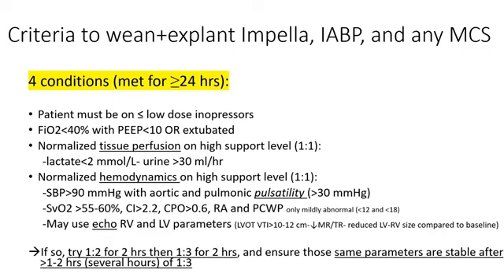So it's nice to have a mechanical circulatory support to support the patient during the stress and loading increase of extubation. The counter argument is that, okay, you tolerate extubation more if you have balloon pump in place, but guess what? You tolerate weaning the balloon pump more if you're still intubated and reducing the work of breathing and providing better O2 supply. So there are arguments for both, but both ways are okay.